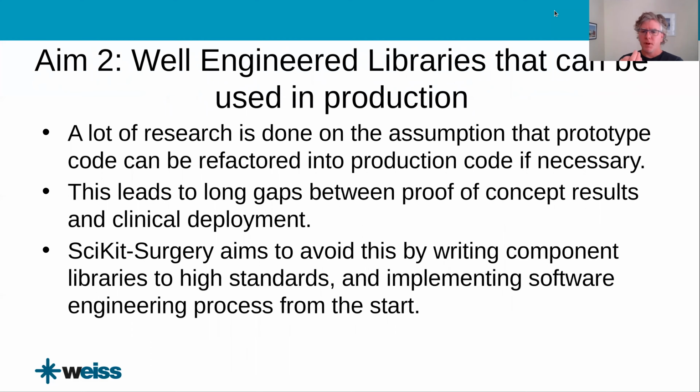The last aim, well-engineered libraries that can be used in production. So typically, a lot of research academically is done on the assumption that you're building prototype code. You can prototype, you can do a bit of research, you can write your paper. If it all works, you can at some stage refactor the whole thing, getting some engineers in to turn it into production code. But the net result of that is massive gaps between doing your proof of concept result and getting clinical deployment. So SciKit-Surgery aims to avoid this.